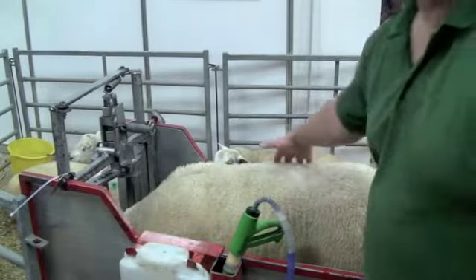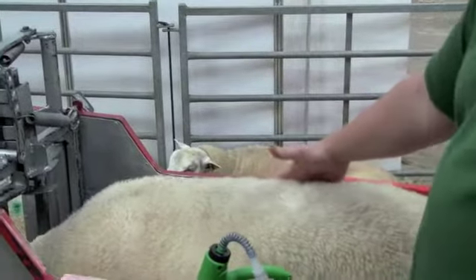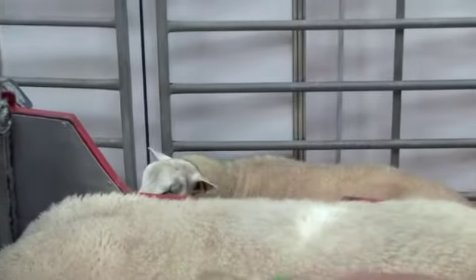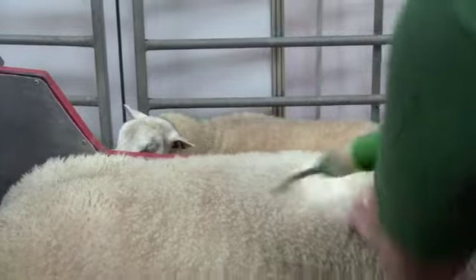Procedure-wise, we find the third lumbar vertebra on the lambs and then we part the wool there, so we're giving each lamb the same chance and we measure in the same place. In the parted wool we use a bit of liquid paraffin to get contact with the skin.